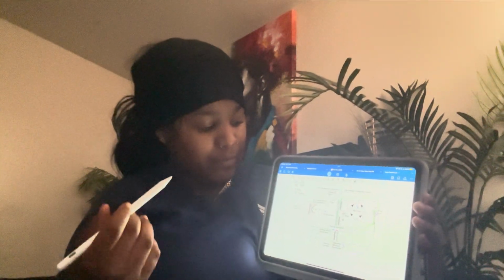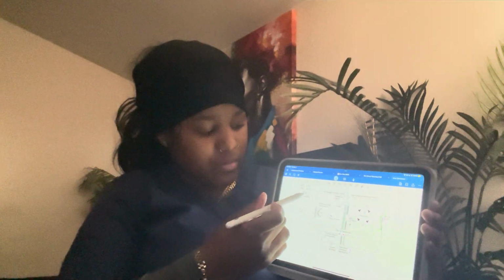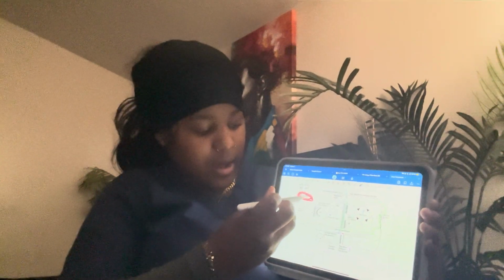So basically today, before I get further into the actual circuit, I'll be utilizing 65 kVp, 30 mA, 0.3 seconds, which is going to conclude my 9 mAs total.